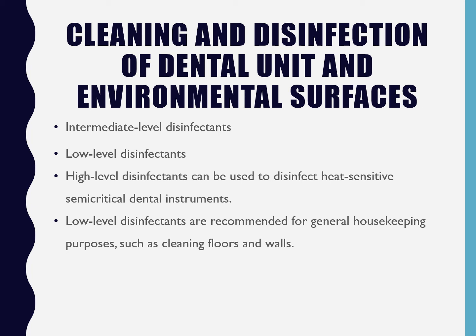I'm surprised that the office is still around, and I don't know if they've changed. I'm hoping that maybe my walking out helped them to understand that what they were doing was not appropriate. It is important that you report them. I didn't do that, but I did report it to the temp agency. I'm hoping they report it. I don't know, but I want you to keep in mind that the instruments we use in radiology, the things that go inside the patient's mouth, not the sensors, are semi-critical instruments. They need to be sterilized.